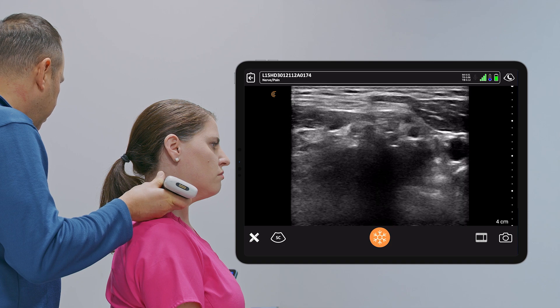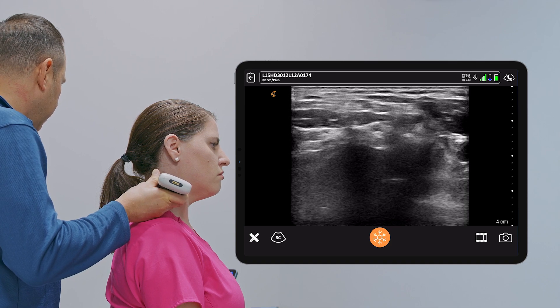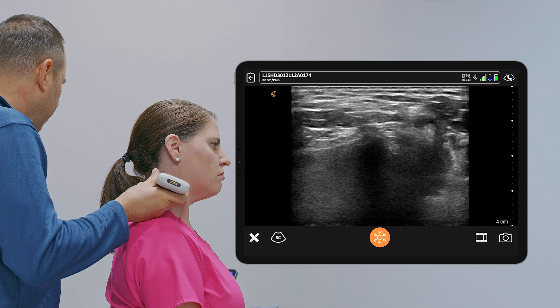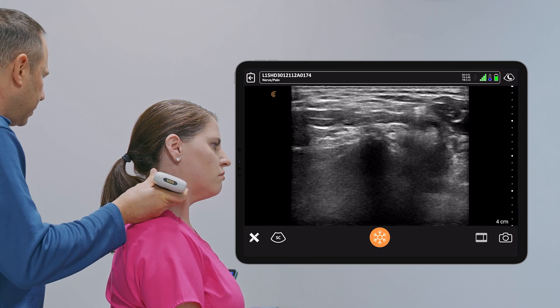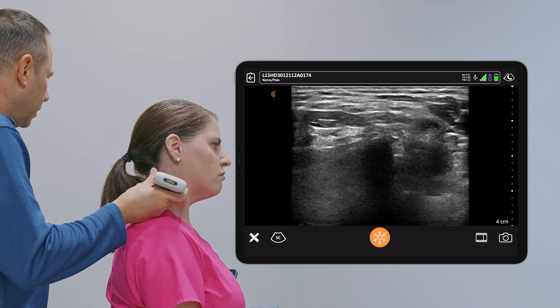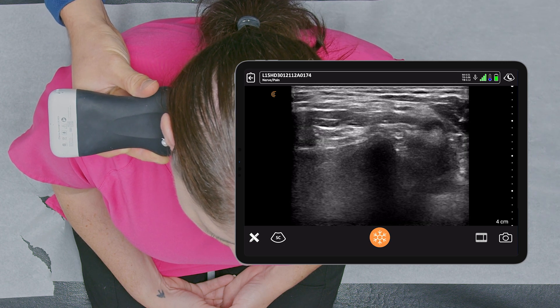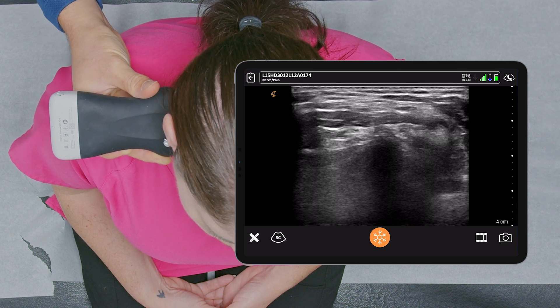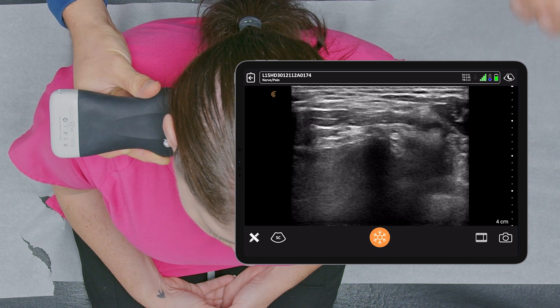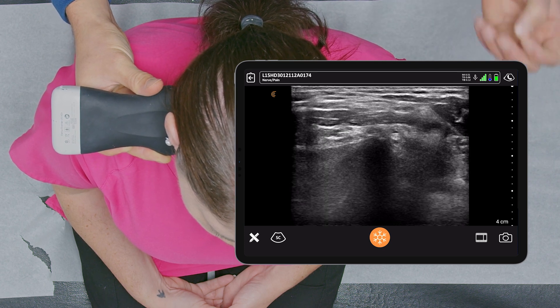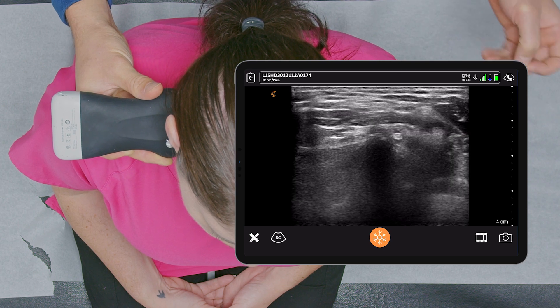Scanning up her spine, I'm looking at the cervical foramen and the nerves going into the foramen. Above the level of C5, the posterior tubercle is larger than the anterior tubercle — that's one way to distinguish between C4 and C3 versus C5 and C6. C6 is Chassaignac's tubercle, which is the largest of the anterior tubercles.